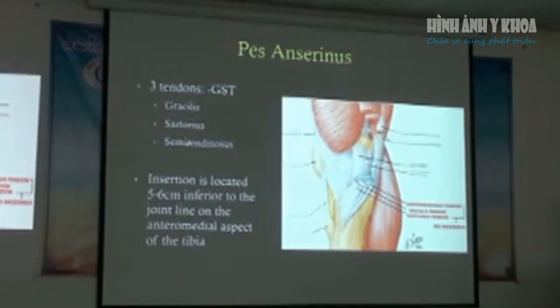These occur more distal to the joint line. So typically these patients say that they've got pain on the medial aspect of the knee, but it's just below the joint line. Nếu mà bệnh nhân có than đau ở mặt trong gối và là cái vùng đau nằm thấp hơn cái khe khớp gối thì mình sẽ nghĩ đến bệnh lý của gân chân ngỗng.